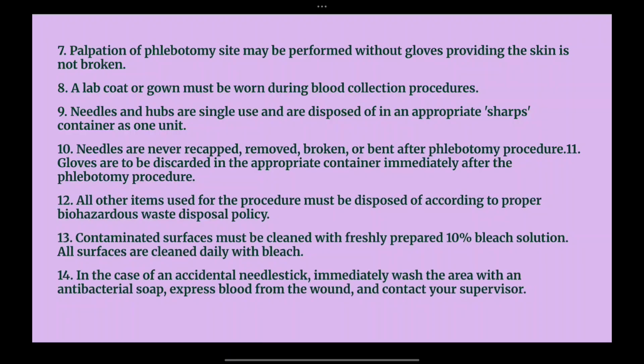Gloves are to be discarded in an appropriate container immediately after a phlebotomy procedure is performed. You're not supposed to wear the same gloves and touch the blood bottles. So once the blood is drawn and the patient is bandaged, you are going to remove your gloves immediately after the procedure is performed, and they should be put into properly labeled containers for the gloves.